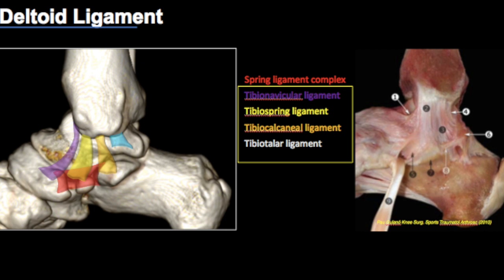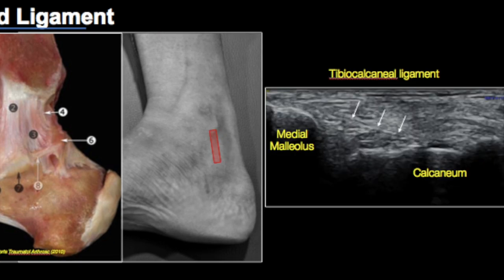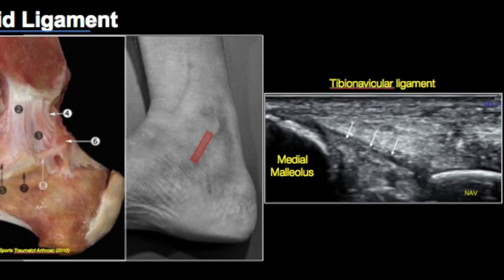We put the proximal end of the probe over the medial malleolus and swing the probe from posterior to anterior, using the medial malleolus as a fulcrum — the movement of the probe is like that of a fan. Posteriorly we see the tibiotalar ligament, then the tibiocalcaneal ligament, the tibiospring component, and anteriorly the tibionavicular ligament.